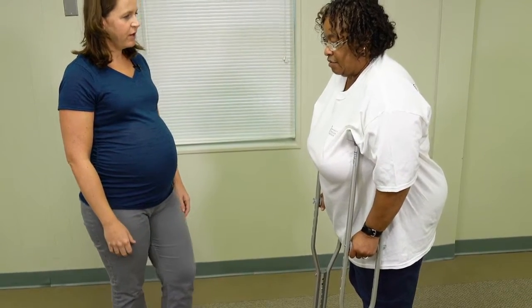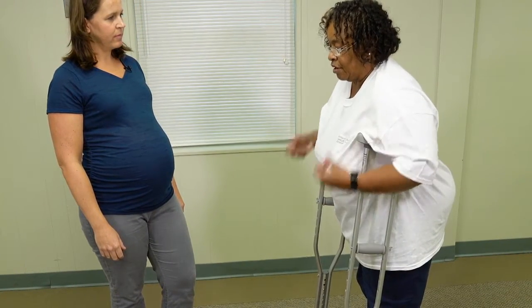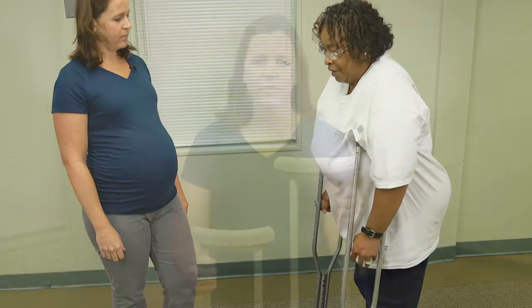How does that feel for you? That feels pretty good under my arms. I have room. It's not rubbing. When walking with crutches, I highly recommend wearing a good tennis shoe or sneaker that has traction on it. Please do not wear flip-flops, open back shoes, or high heels, as these are not safe shoe wear.